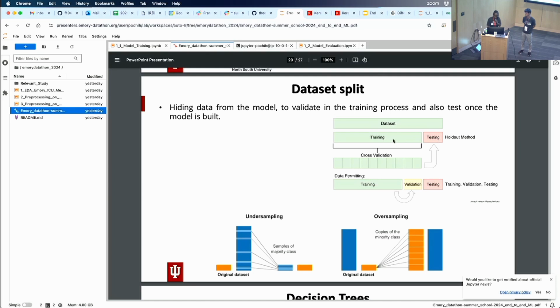Then your training data, you can have cross-validation, but most of the time, and I don't want to go down there first, you now have your training and validation data set. Okay, so training and validation are part of your training data set. So when you climb up the mountain, right, and you're saying, am I learning the right thing or the wrong thing?